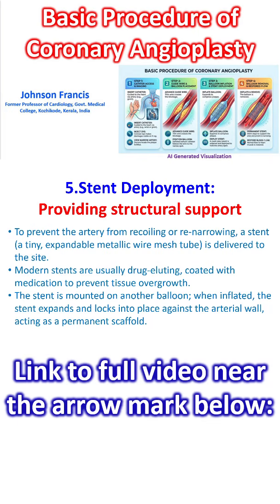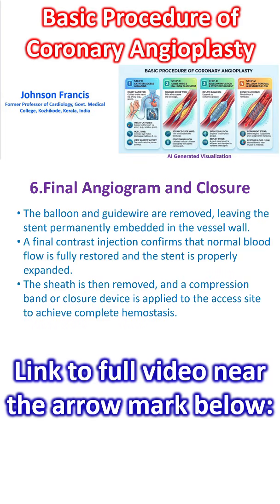The stent is mounted on another balloon. When inflated, the stent expands and locks into place against the arterial wall, acting as a permanent scaffold. Final angiogram and closure. The balloon and guide wire are removed, leaving the stent permanently embedded in the vessel wall.